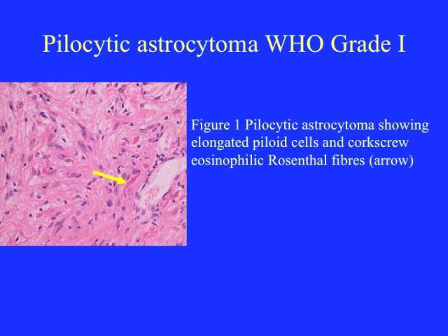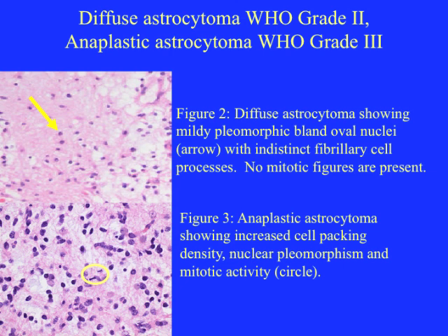As mentioned before, pyelocytic astrocytomas can be very difficult for neuropathologists because they often show microvascular proliferation and necrosis, though this is not the case in the image shown here. These images show a diffuse astrocytoma WHO grade 2 and an anaplastic astrocytoma WHO grade 3. The diffuse astrocytoma is very bland with oval nuclei, indistinct fibrillary cell processes, and no mitotic figures. These can be difficult to distinguish from reactive processes. By contrast, the anaplastic astrocytoma shows increased cellular packing density, nuclear pleomorphism, and mitotic activity — the mitosis is highlighted in the yellow circle.